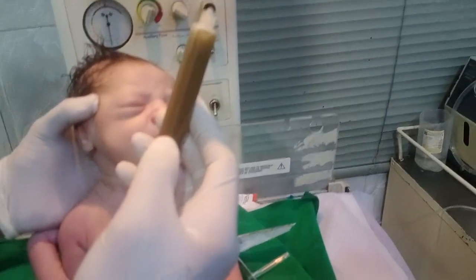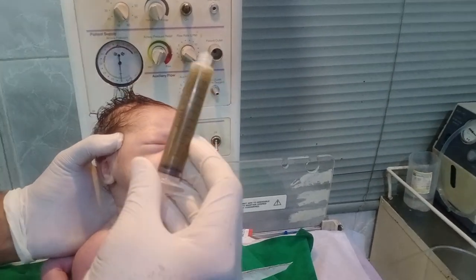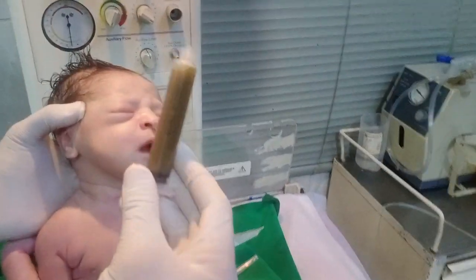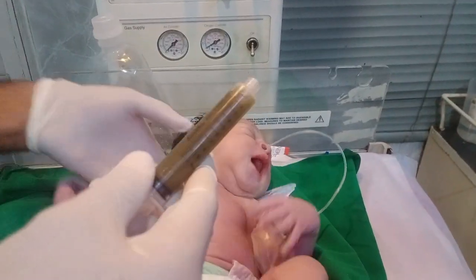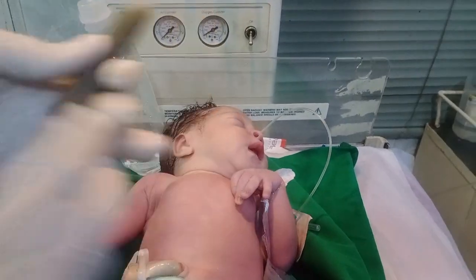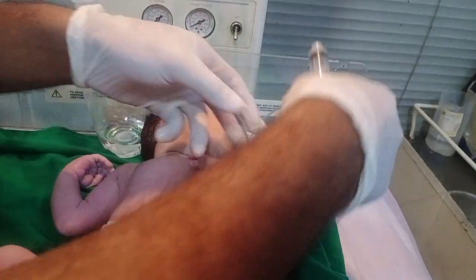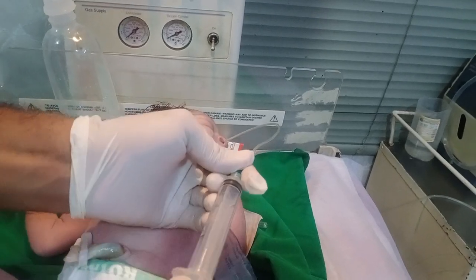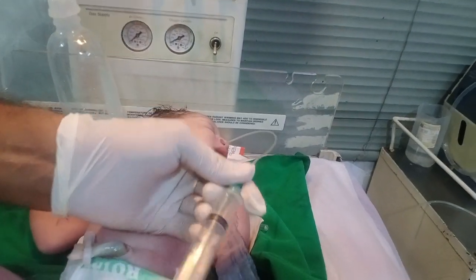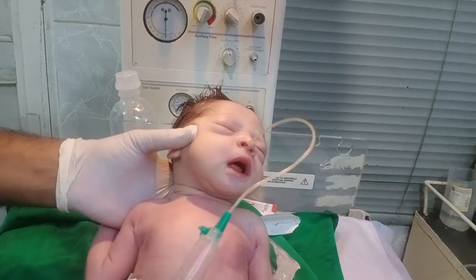If retained, this material causes vomiting and can lead to septicemia — a severe bacterial infection. I am expelling it now. Look at that — I have removed a minimum of 10 ml of toxic meconium from the baby.